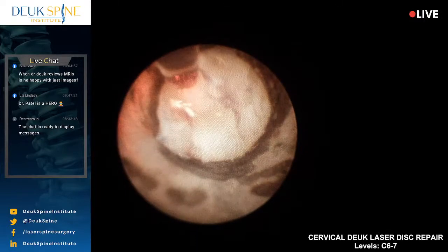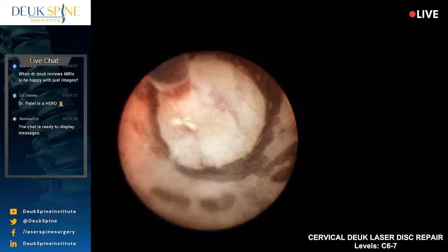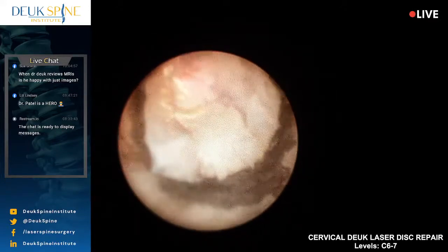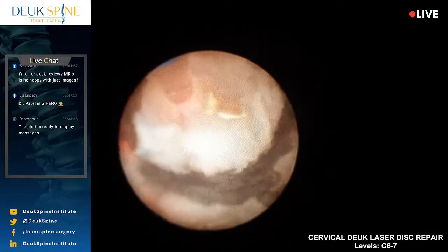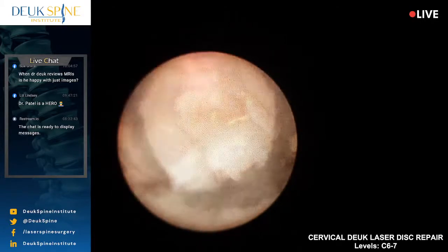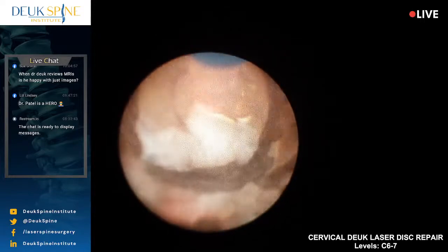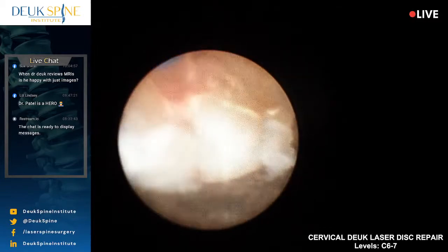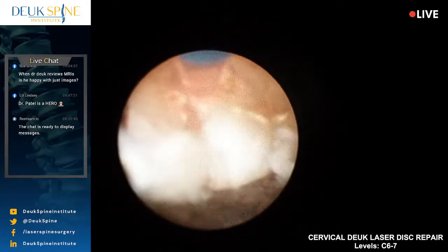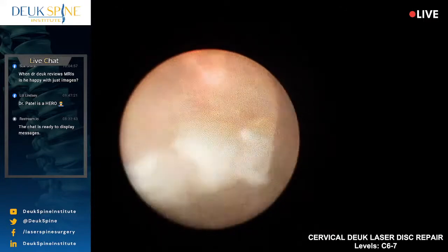The laser is pushing backwards. The laser fiber is at 12 o'clock on your screen, and that's all calcified herniated disc right there. Look at the golden color. The golden color is calcium or bone spur, basically. A lot of calcium.